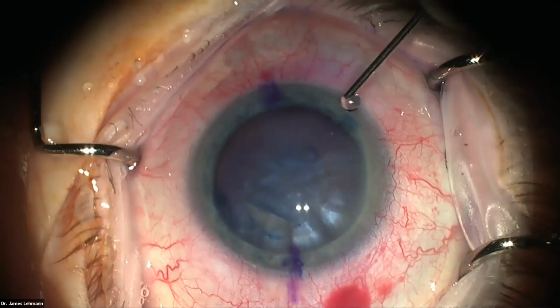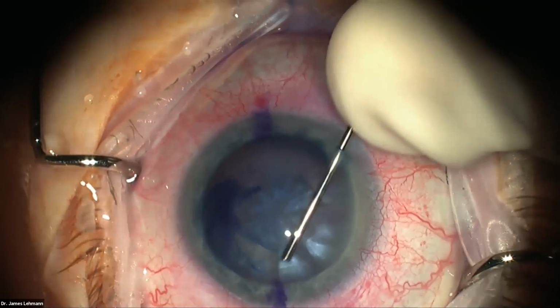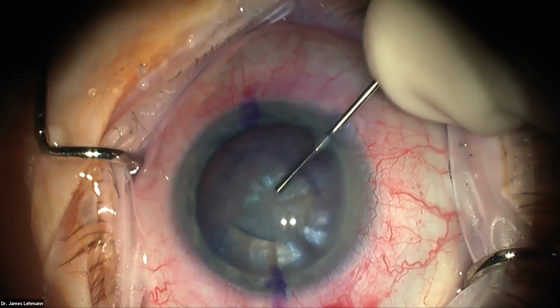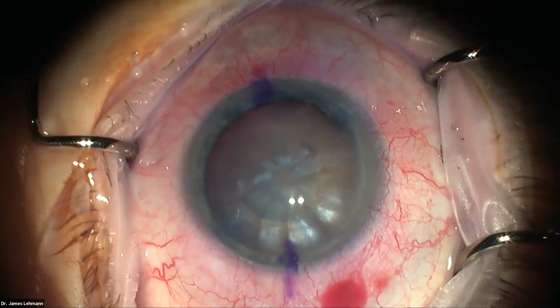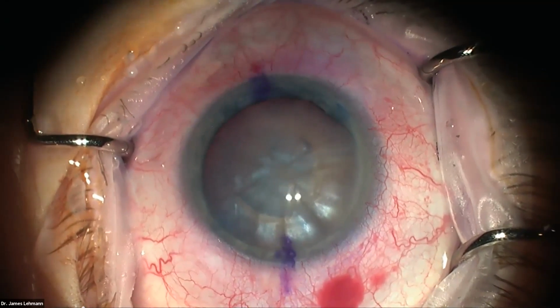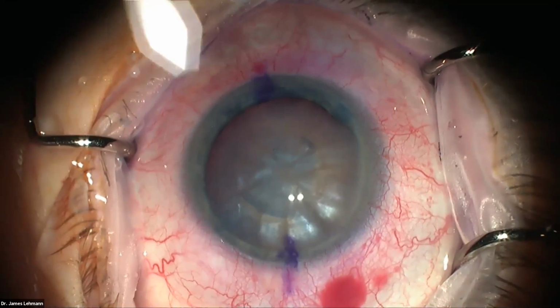Again, like Dr. Trowick said, this patient is blocked. She was very nervous and had a hard time keeping her lids open, so we didn't want to make it any harder than it should be. And so I cleared things up. You can see the Rhexis, the capsulotomy is good, and we're going to make our main wound here, and then I'll go in with some Utrata forceps to remove it.